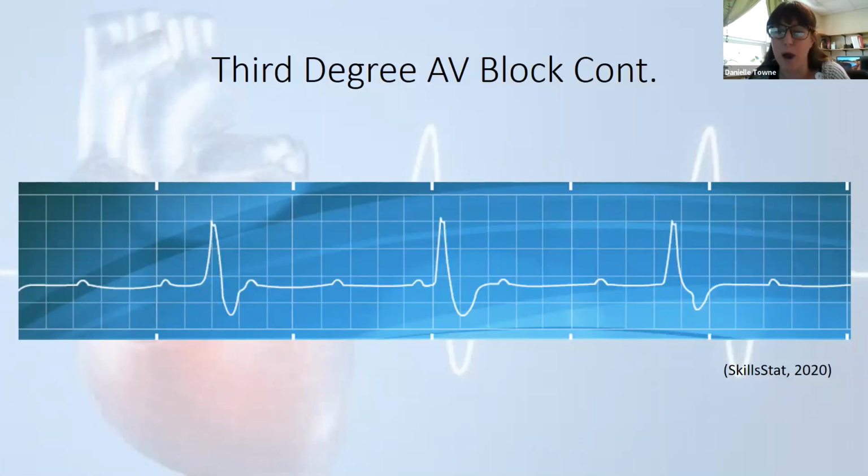So transcutaneous pacing is really our primary option in this. Works really well. Just remember that once you start getting that cardiac output up by increasing their heart rate, they're probably going to need some sedation. So just keep in mind that while they may be minimally responsive when you start, by the time you get them up to a well-perfusing rate and improve their blood pressure, they're going to be getting more oxygen and nutrients to their brain, which is going to make them wake up, which is probably going to make them need sedation because transcutaneous pacing, from what I hear, is not very comfortable.